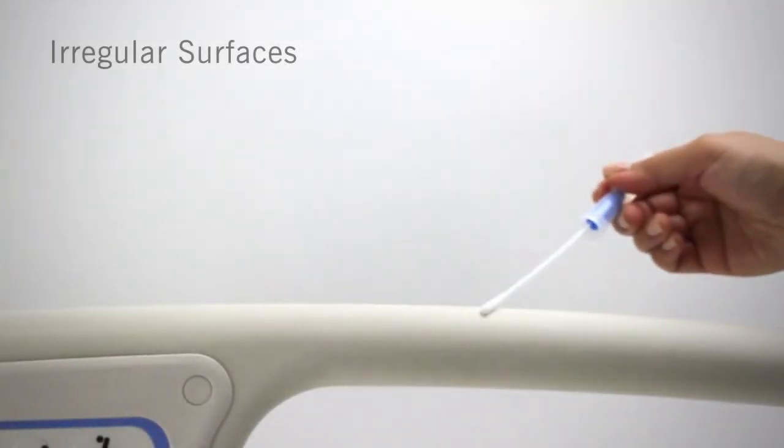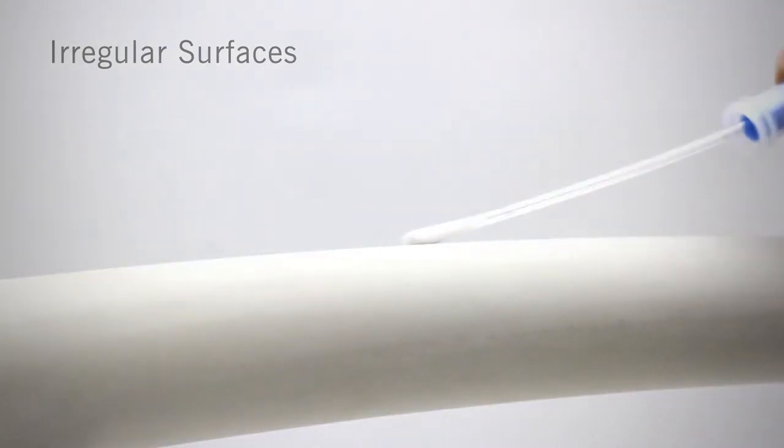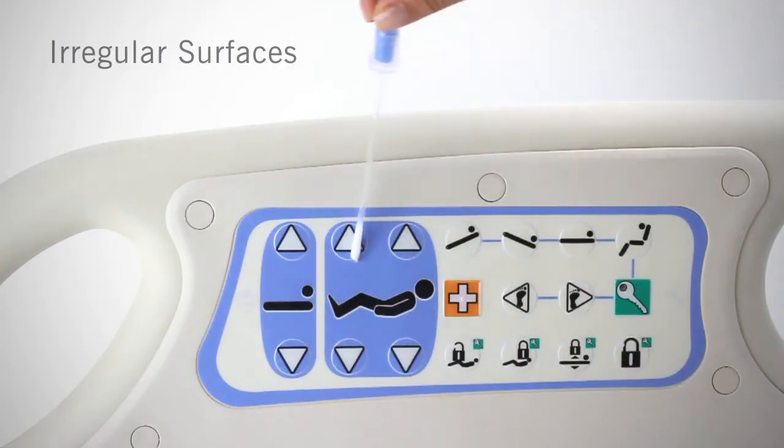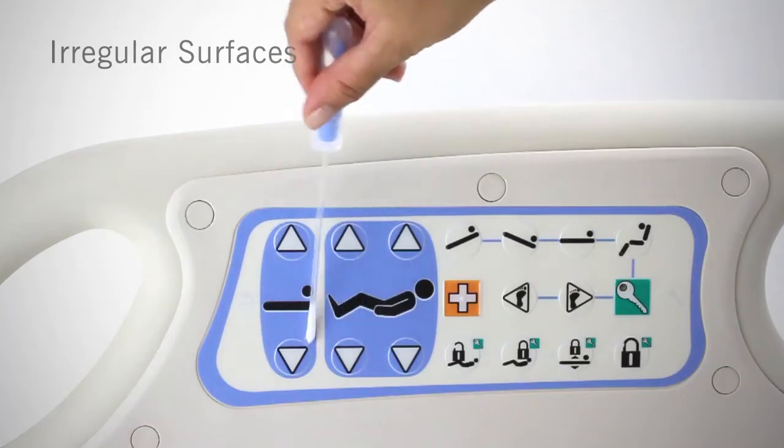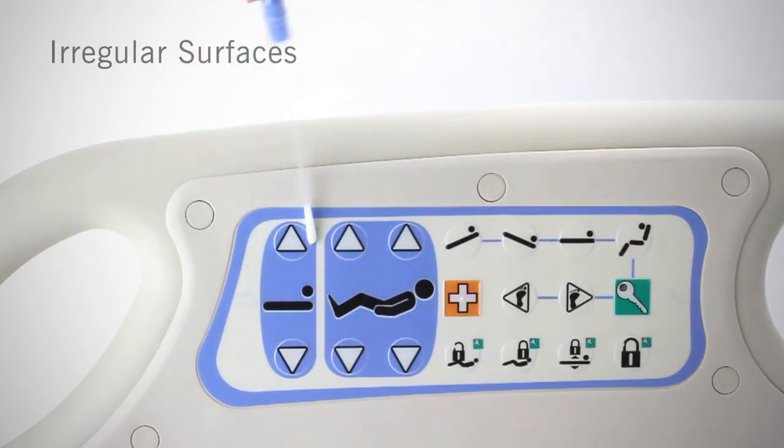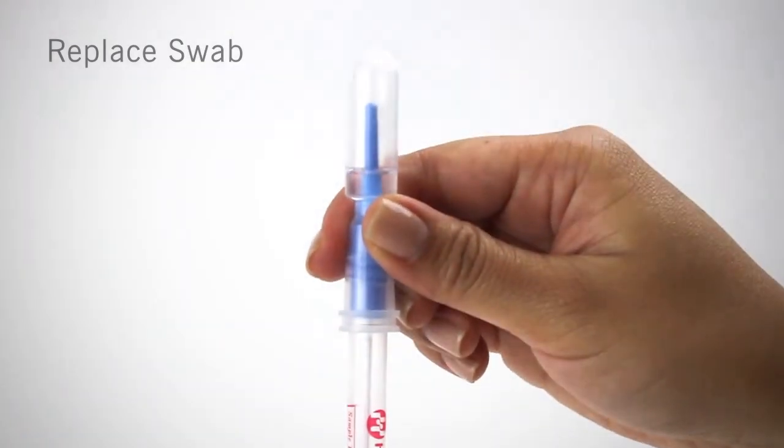When swabbing an irregular surface, such as a door handle, light switch, bed rail, or monitor panel, ensure the swabbing technique remains consistent and swab a large enough area to collect a representative sample. After you've finished swabbing, replace the swab in the tube.